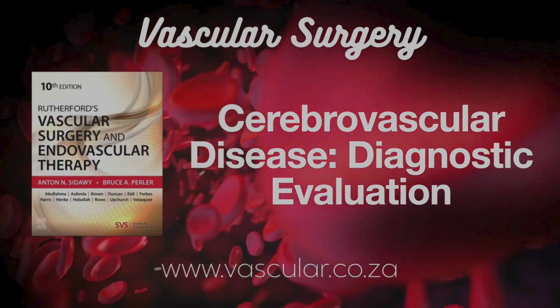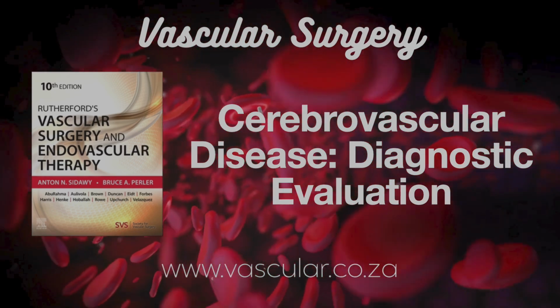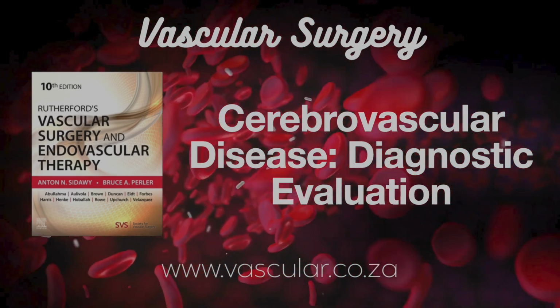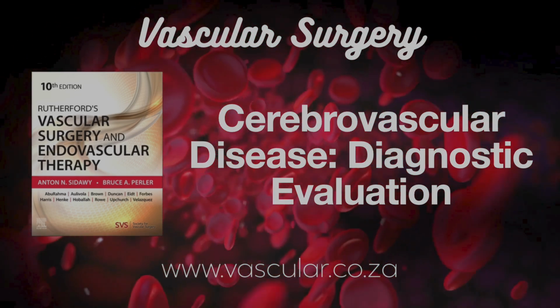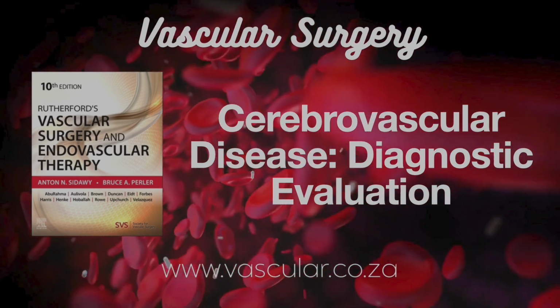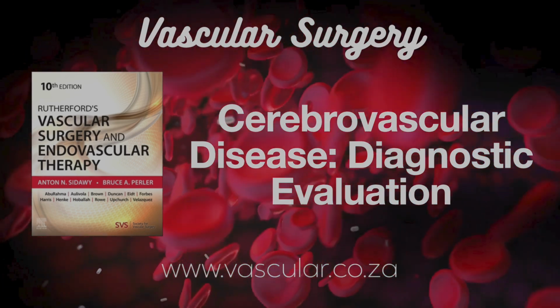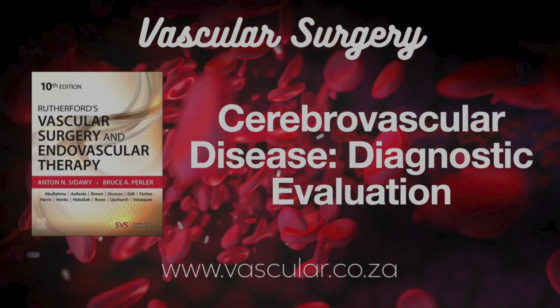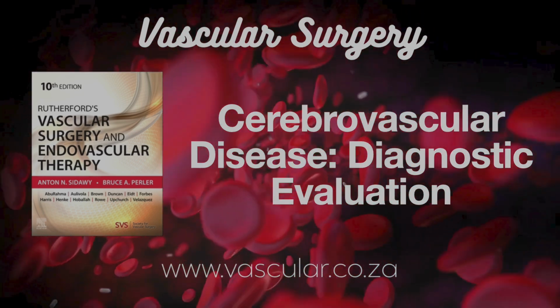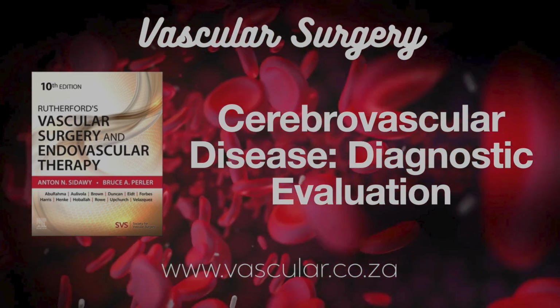Now let's talk planning. How does imaging guide the actual procedures, like CEA versus stenting? For a carotid endarterectomy, the surgical cleanout, if the DU clearly shows high-grade stenosis, 70 to 99% asymptomatic or 50% symptomatic with clear deficits, CEA can often proceed based on DU alone. You mentioned that high percentage earlier. Yeah, in experienced hands with good quality ultrasound, it's often sufficient.